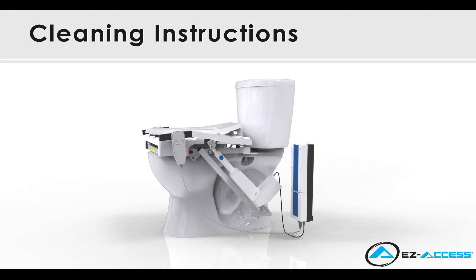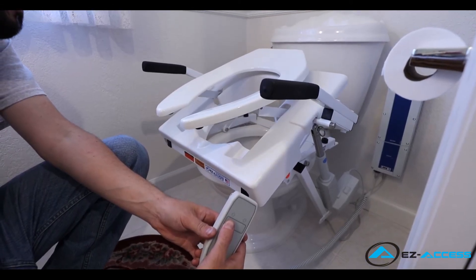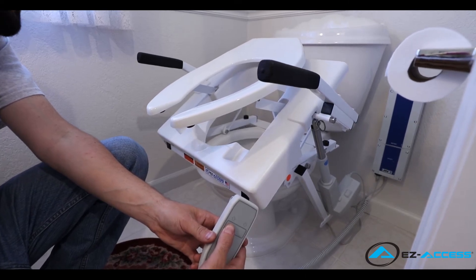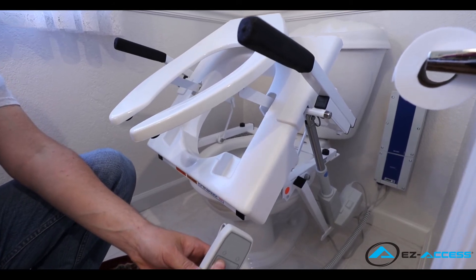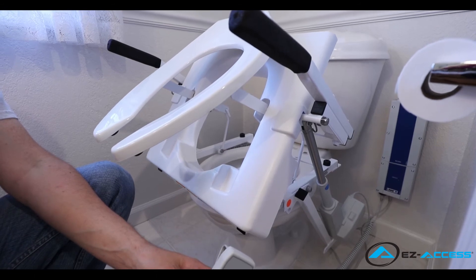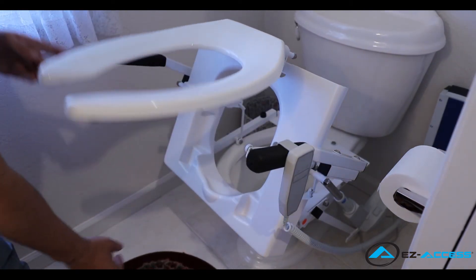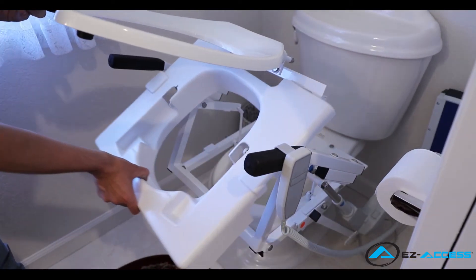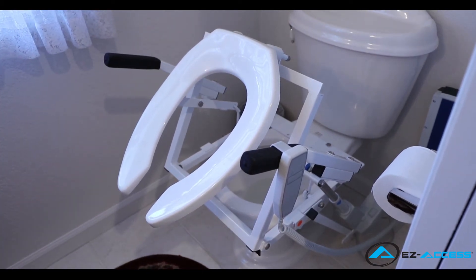For cleaning instructions, you can follow a few simple steps. Using the handheld control, raise the tilt into its up position. Lift the toilet seat up and grab the front of the shield. Pull upward and then forward until the shield slides off the frame. Use a soft cloth with warm water and a mild soap to wipe the shield down. Refer to the instruction manual for further cleaning details.